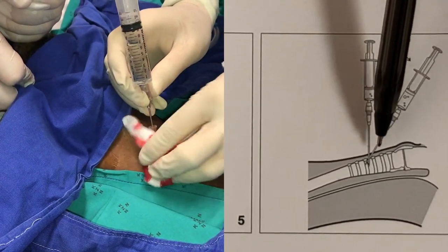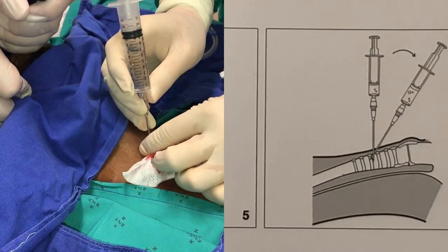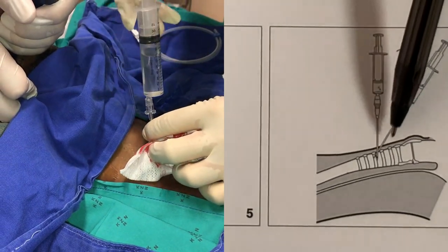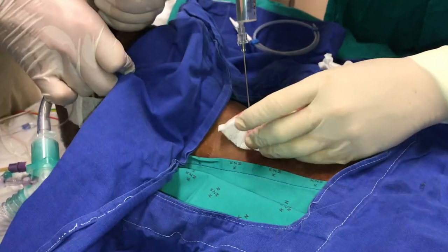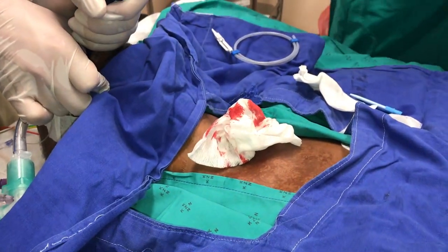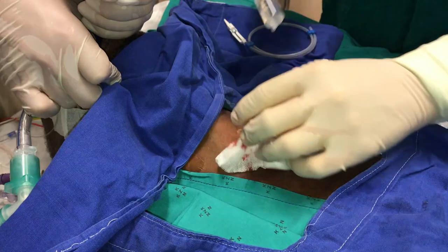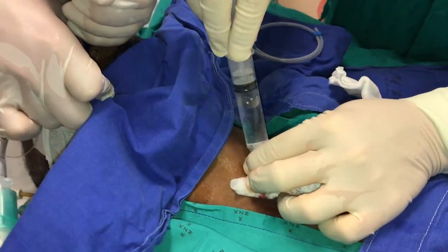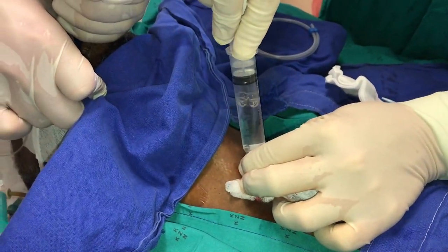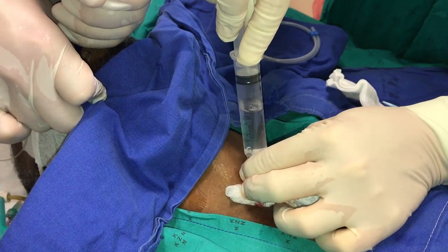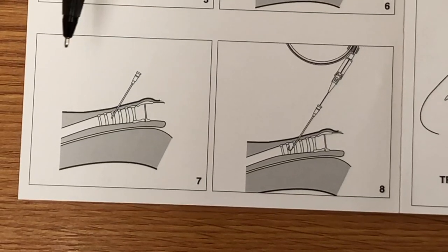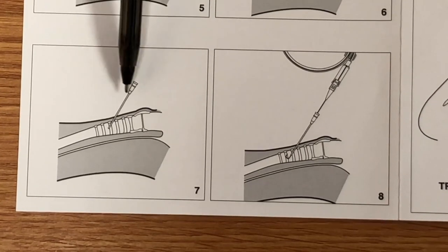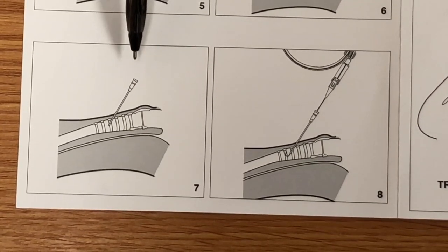If you have successfully sited the IV cannula, attach a syringe and make sure there's still free flow of air. This now represents the IV cannula properly sited. I normally let the IV cannula go until it is at the hub to ensure that it is actually in the trachea, and that's my clinical confirmation that I'm in the trachea. After this step, the rest of the procedure follows a mechanical sequence.